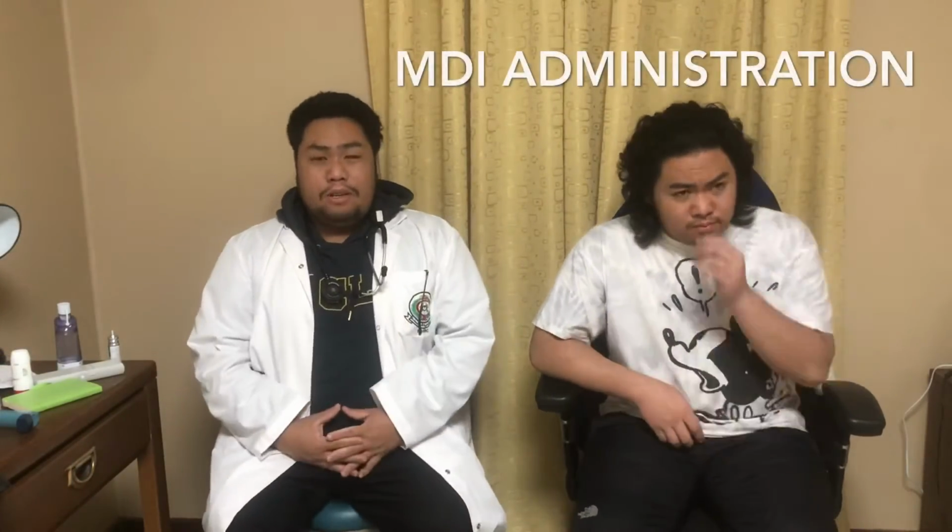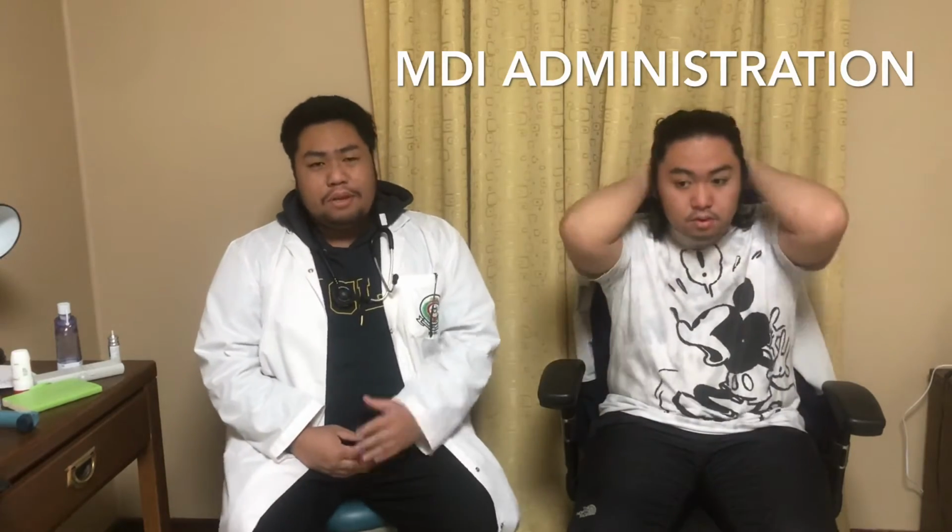After assessing the patient and reevaluating their papers and such, we're now ready to proceed to the next step. The next step is to make sure to shake and prime your canister. Basically, put it on its mouthpiece, shake it, and then spray it 1 time, shake it again, then spray it another time. The main purpose is to surely give the right dose to the patient, and at the same time, make sure to mix all the medicine inside.